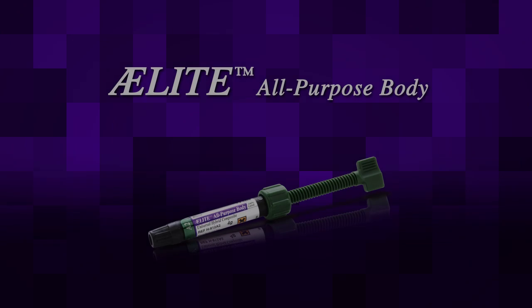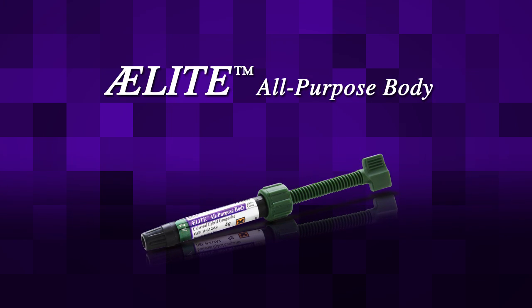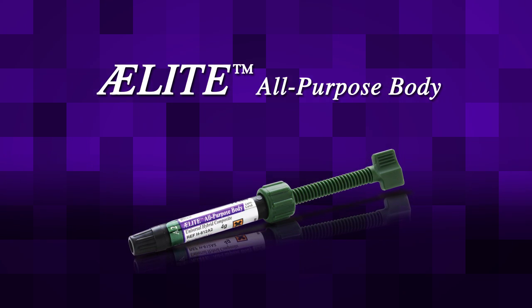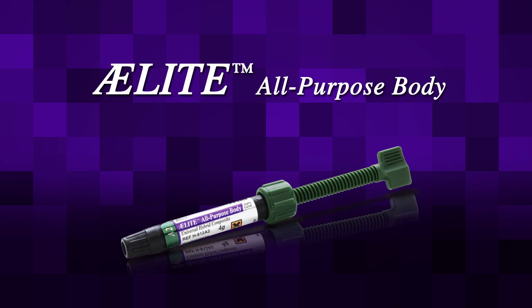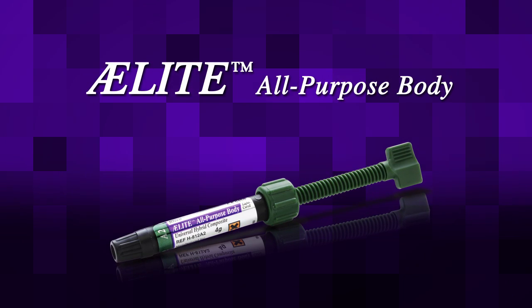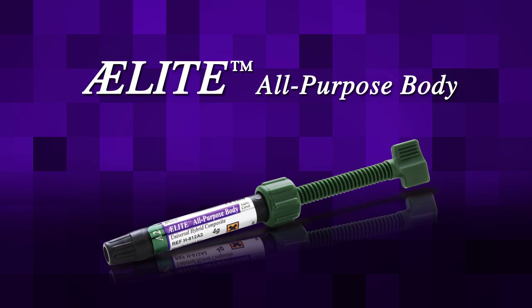A light-cured restorative composite is used to fill the cavity. Bisco's Elite Composites are aesthetic, durable, and available in a variety of shades to mimic the natural dentition. Bisco's Elite All Purpose Body is selected as a dentin buildup. Its unique handling allows the clinician to properly place and adapt the material into the preparation.